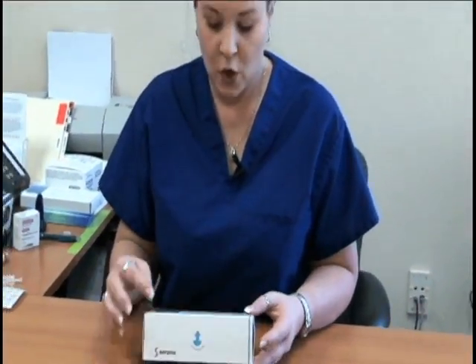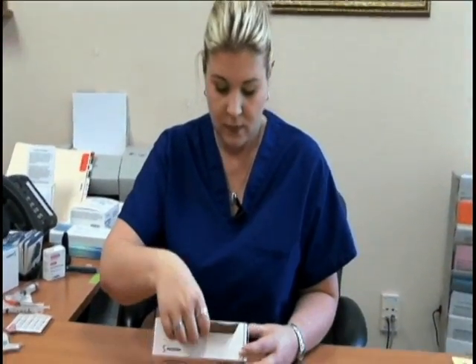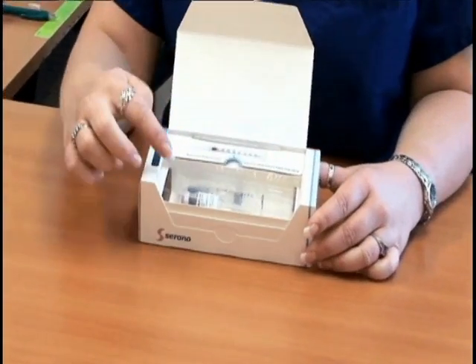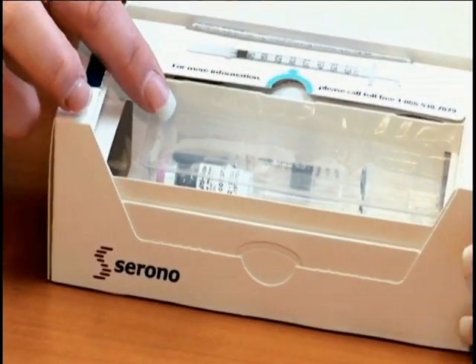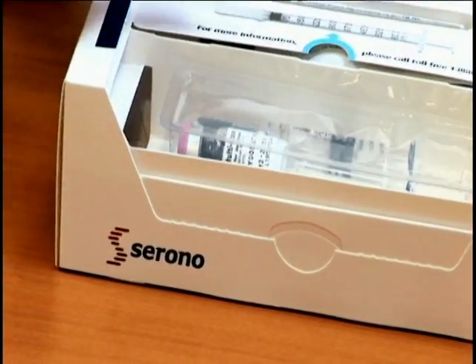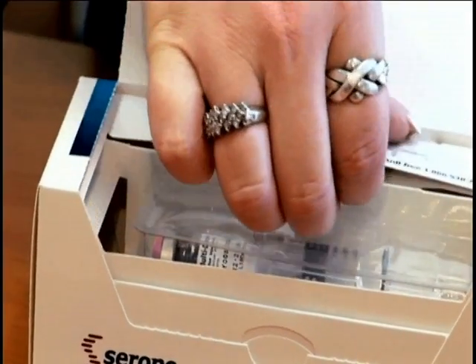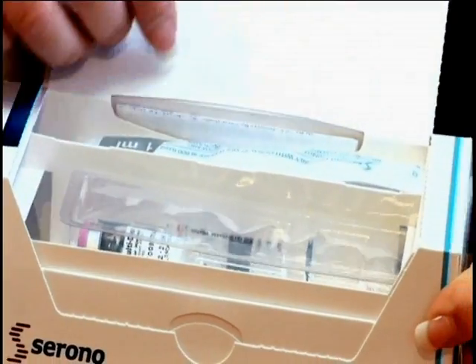What you want to do is open up the box. When you open up the box, you will see the medication in a vial, a pre-filled syringe, and there's also a spot where you see the actual syringe. When you open that part up, that's where all of the syringes that you'll utilize for the Gonalef are stored.